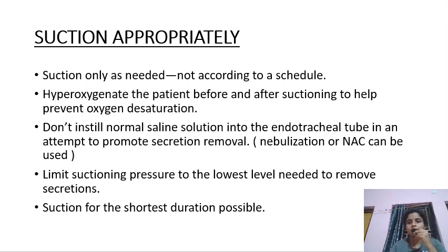Suctioning is a very important nursing care in mechanically ventilated patients. Suction is not routine. It should be done as needed. Always hyperoxygenate the patient before suctioning, to prevent oxygen desaturation. It is a common practice in hospital settings that whenever the secretions are not coming, they instill some normal saline, but this should not be done. Secretion removal should be done with the help of nebulization, chest physiotherapy, or acetylcysteine can be used for that. And limit suctioning pressure to the lowest level as needed to remove the secretions.